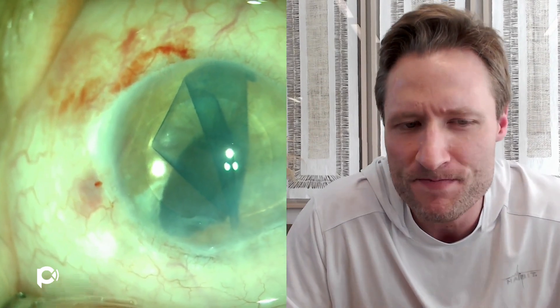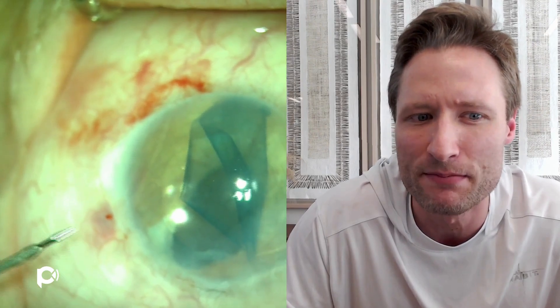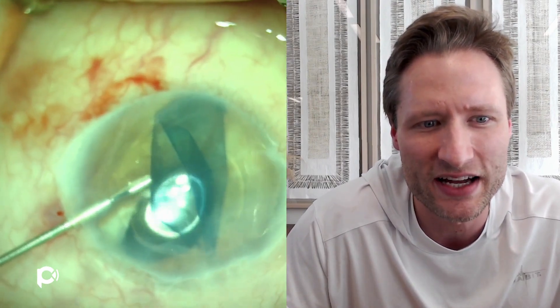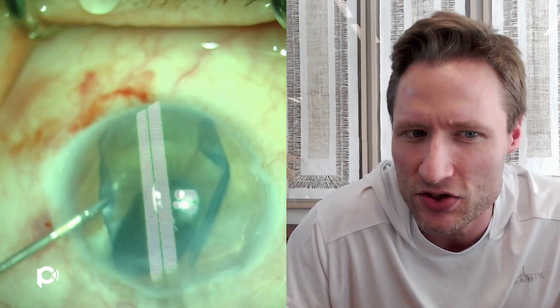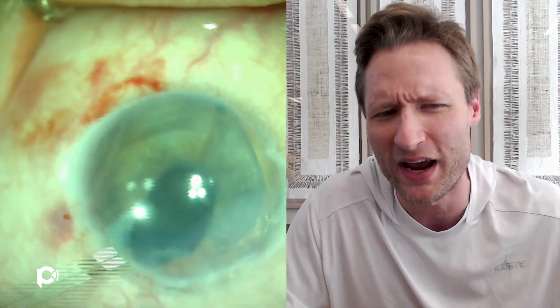What I'm going to do is use coaxial forceps through a paracentesis snuck in from the side to grab the edge of this graft, which I believe is properly right-side up. Because my paracentesis is a little on the small side, I'm having some trouble finagling the forceps into the eye. I come out and try again to grab the edge of the graft — now I've got it, I'm dragging the graft centrally. With some taps on the surface of the eye, you'll notice how easily the graft unfolds. After basically just 10 seconds of manipulation, the graft is completely unfolded in the anterior chamber.